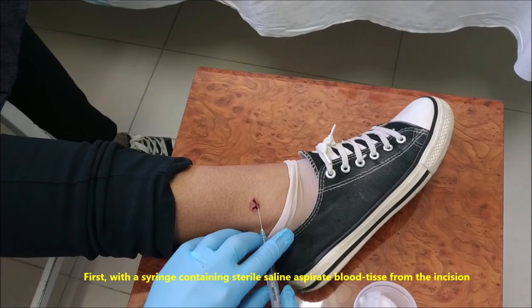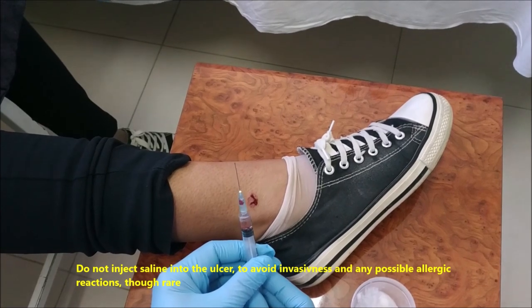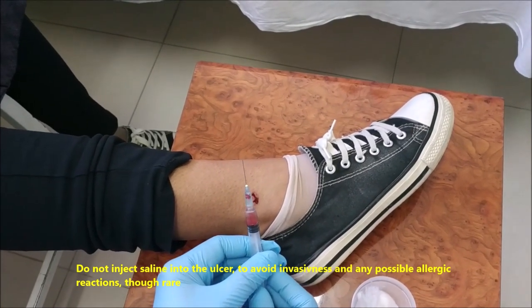Collect tissue fluid from the incision. Do not inject saline into the ulcer to avoid invasiveness and any possible allergic reactions, though rare.